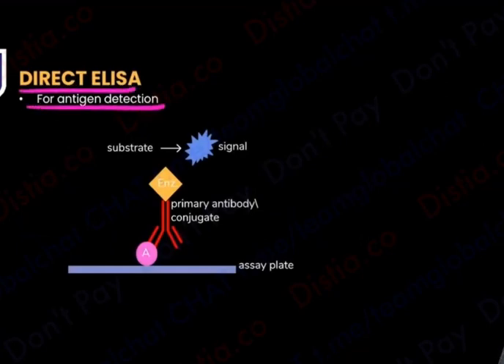So you'll say, ma'am, it is antigen detection. This means this is that ELISA well. If I want to test for the antigen, the first thing that I'll add is the patient sample. I want to find out the antigen in his sample, so I will add the sample first. Then the patient's work is done. He has given me his antigen. Now I will add an antibody in the lab.